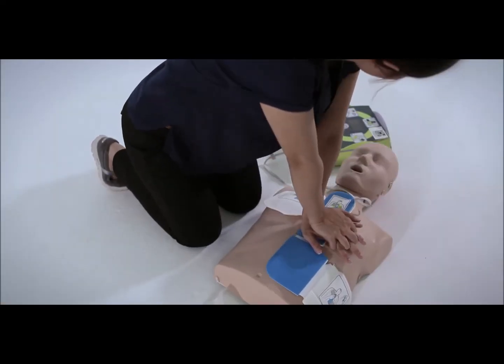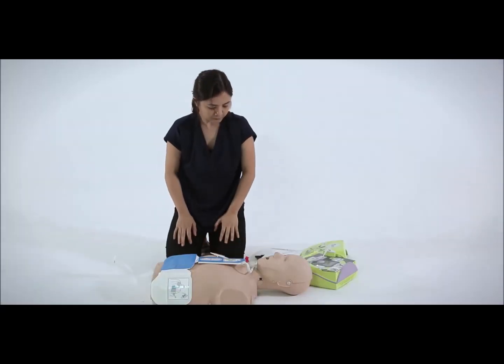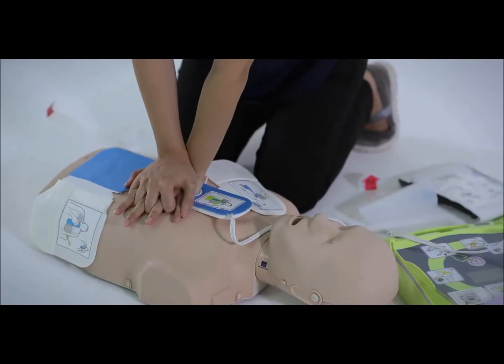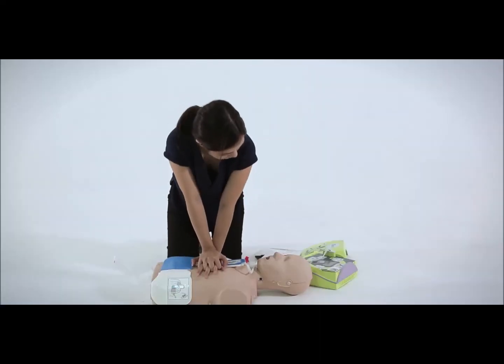If you stop delivering chest compressions and do not start within the next 10 seconds, the AED will prompt you to 'Continue CPR.' The AED will automatically initiate another analysis of the victim's heart rhythm every two minutes and prompt you to deliver another shock if required. Continue using the AED until the victim shows signs of recovery or until professional medical help arrives.